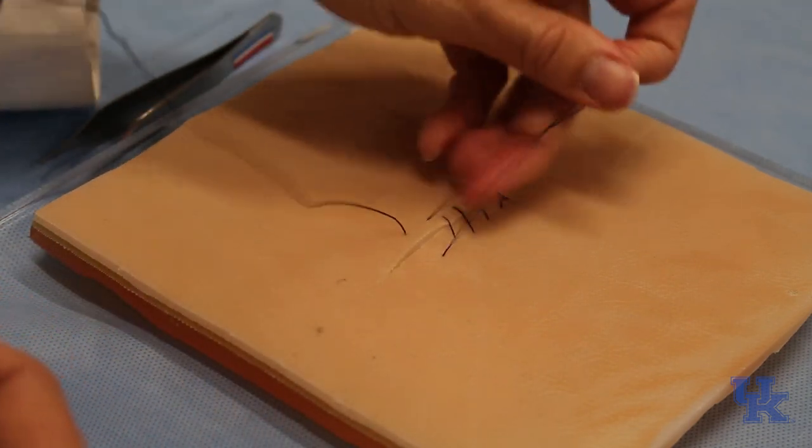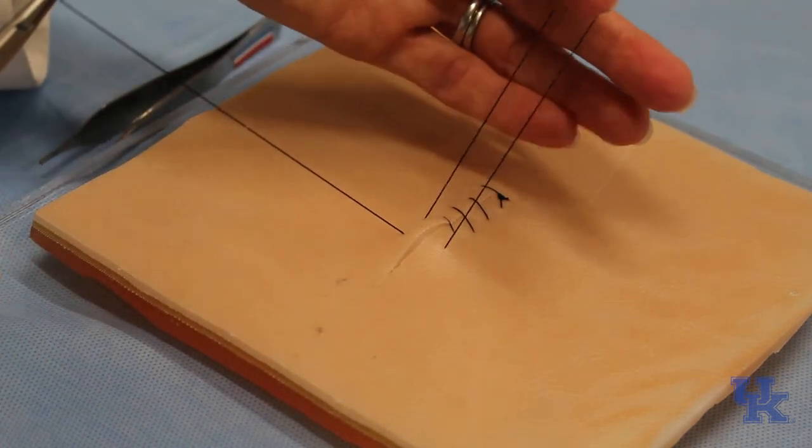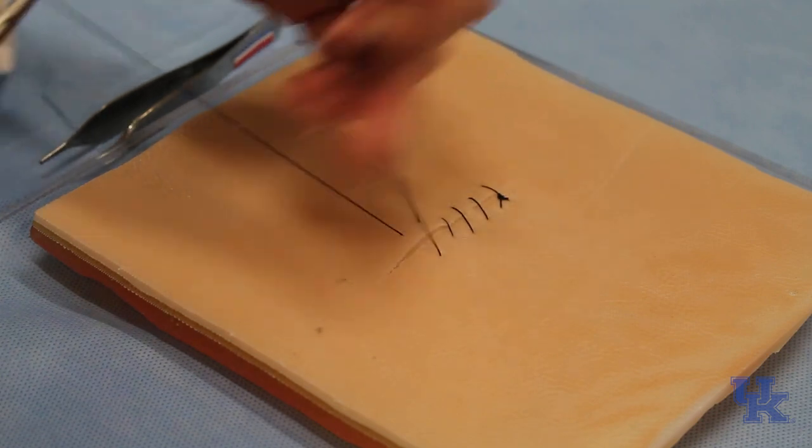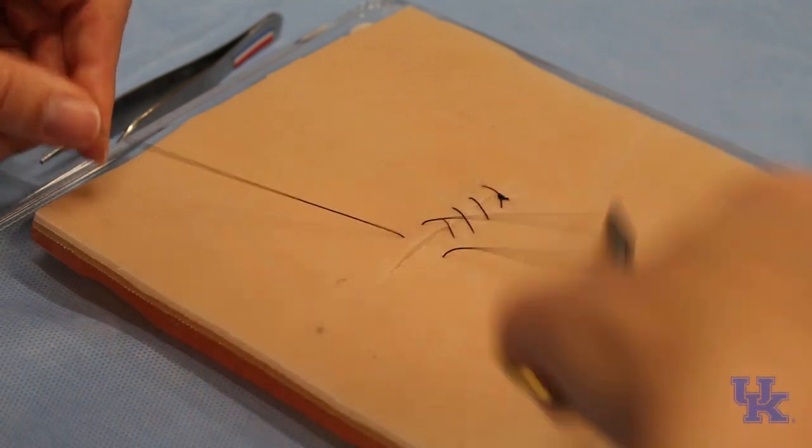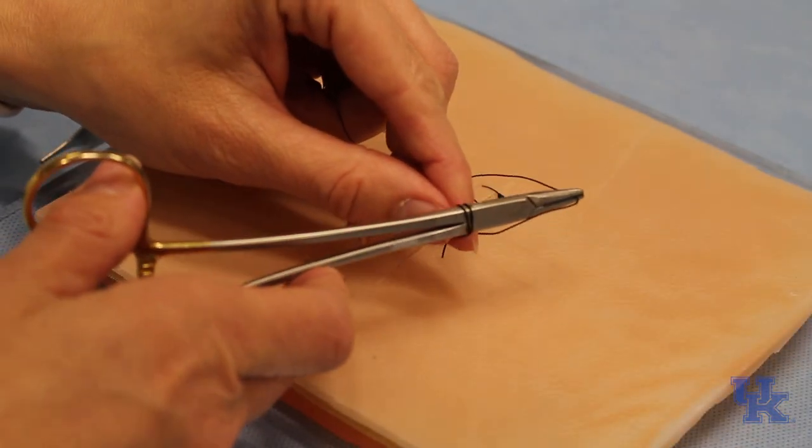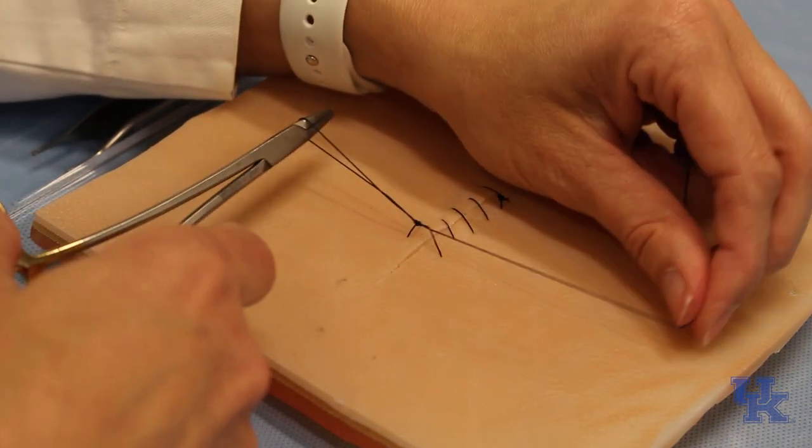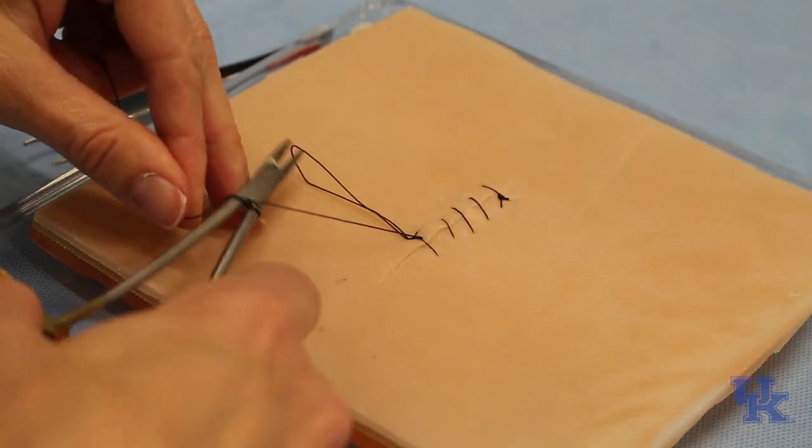So what you're going to have to tie is the loop and the other end. You're going to treat this as if it is a single suture and tie a knot with these things. I'm going to do this with an instrument tie. You're going to do it the exact same way. Now, rather than grabbing that, I can grab it and pull it through, but then I'm going to put this through here so that it pulls down equally. And then you're going to do the exact same thing.